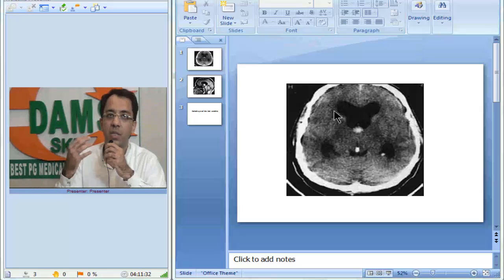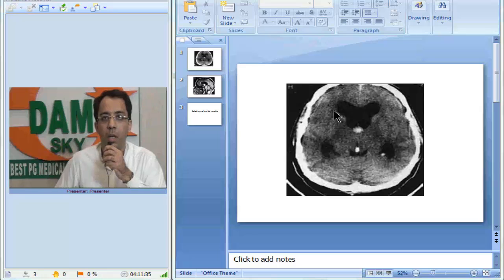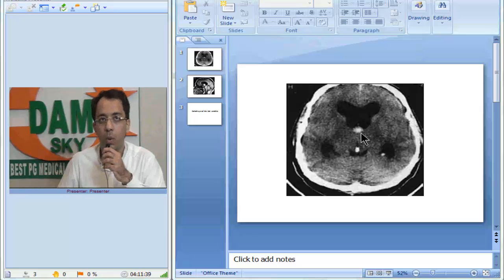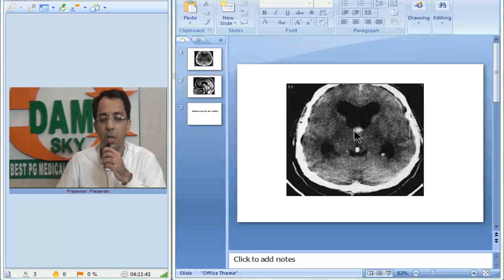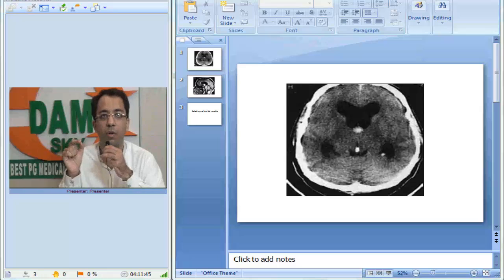So what I see is bilateral ventriculomegaly and a hyperdense, well-defined, rounded lesion in the area of the foramen of Monroe, more dense than the surrounding brain.